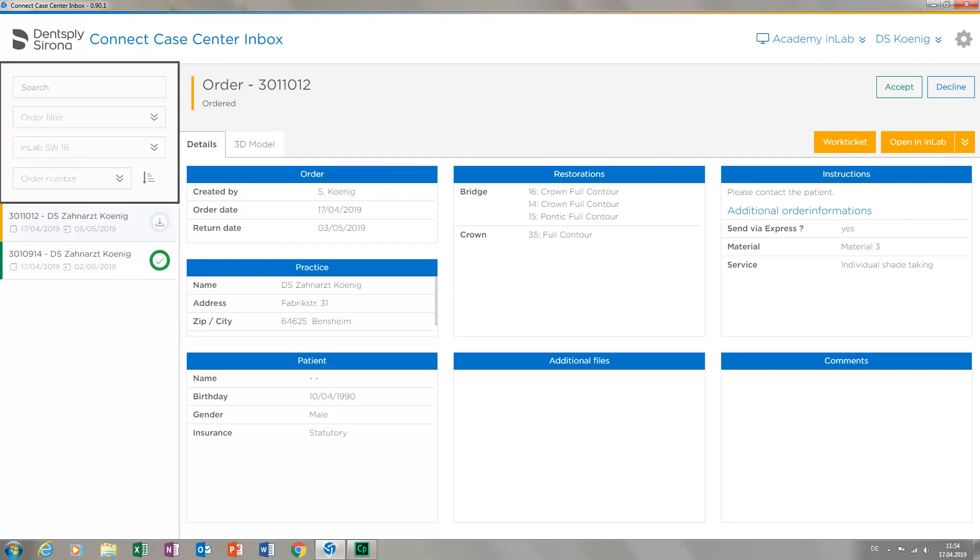At the upper left, you can look for cases with the help of the different options and drop-down menus. Below that, the cases that were already transmitted are displayed.